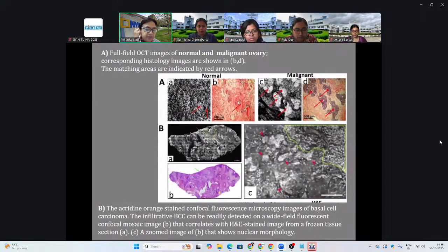These are a little bit harder for me to explain, not being a major cytopathologist, but looking at only 30-day-old tumors, xenograft. That's pretty much what I look at, and this requires heavy expertise. Some of these we are used to looking at, but some of these use fluorescence microscopy, so different kinds of microscopy.